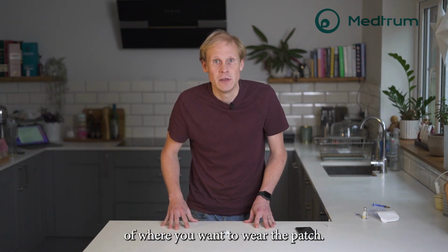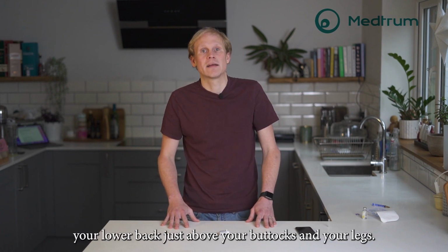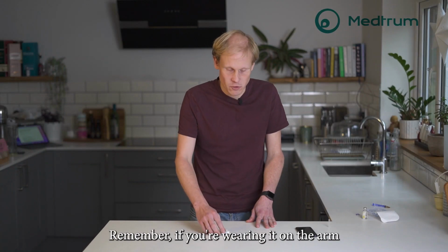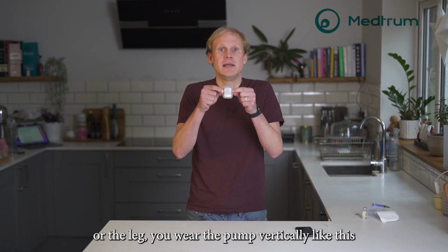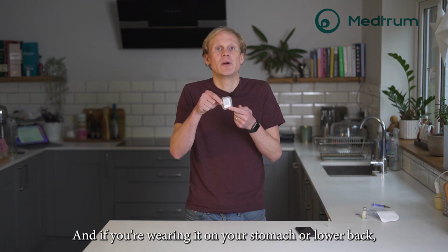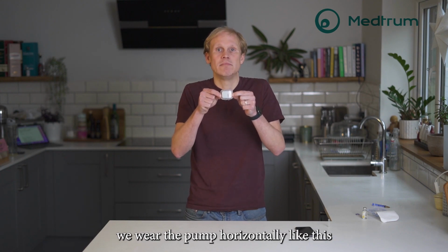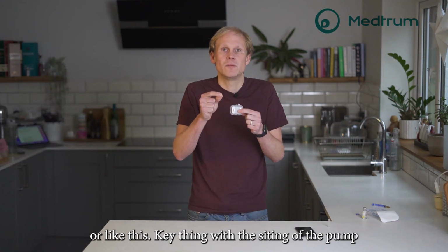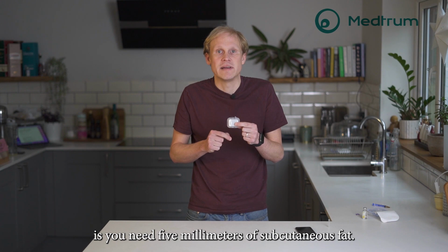You can wear it on your arms, your stomach, your lower back just above your buttocks, and your legs. Remember, if you're wearing it on the arm or the leg, you wear the pump vertically like this with the pump base at the bottom. And if you're wearing it on your stomach or lower back, we wear the pump horizontally like this or like this. Key thing with the siting of the pump is you need 5 millimeters of subcutaneous fat.